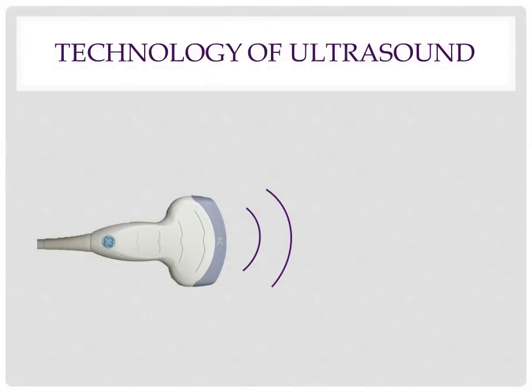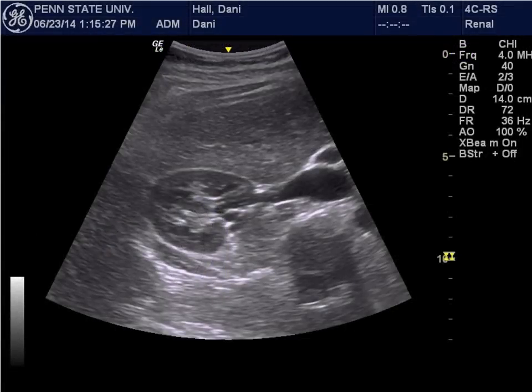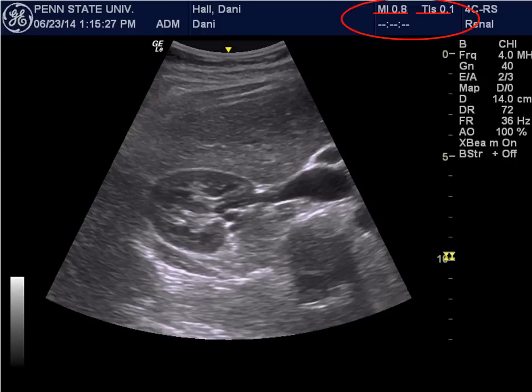Sound waves are energetic waves, and although they are safer than other imaging technology, if used for too long, ultrasound waves can be harmful. In the upper right-hand corner of your ultrasound screen, you will see two numbers indicating the TI, or thermal index, and MI, the mechanical index. These levels are there to protect patients from any harm caused by an ultrasound exam. There have not been any reported cases of damage caused by an ultrasound exam in humans, but these indexes have been studied in animals.